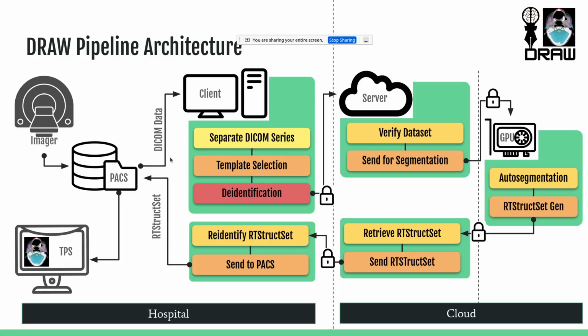What it does is that it lives on a separate desktop computer, which is a very simple desktop computer. It regularly pulls data from this data store at predefined intervals. So it depends on the caseload that you have. In our center, for example, we define it to pull every 10 minutes. So every 10 minutes it will query for new data that has come inside this data store.